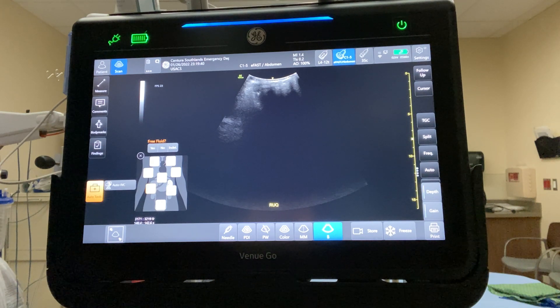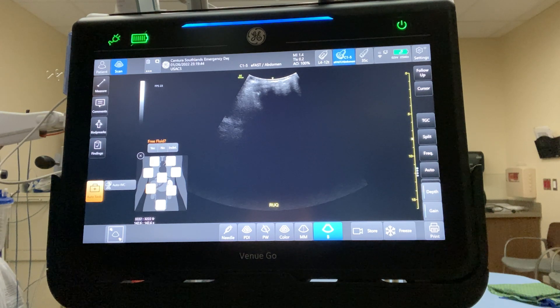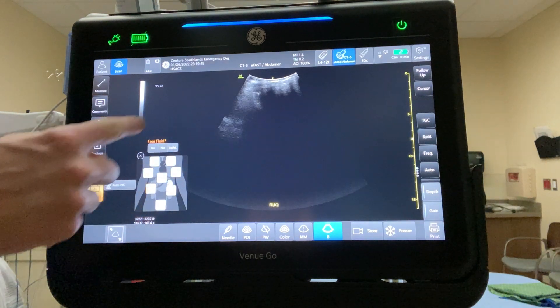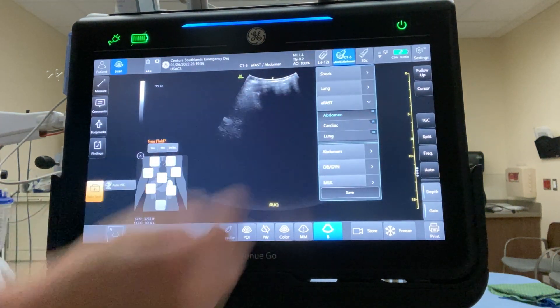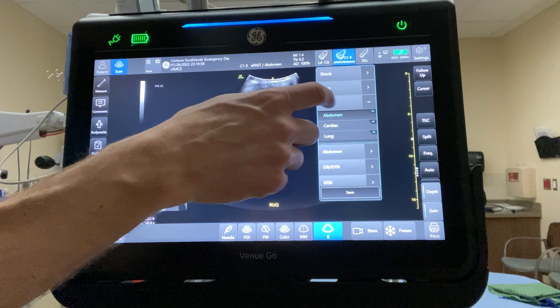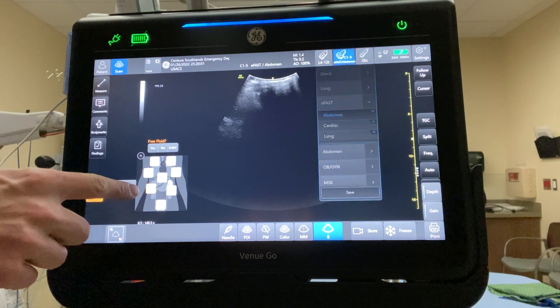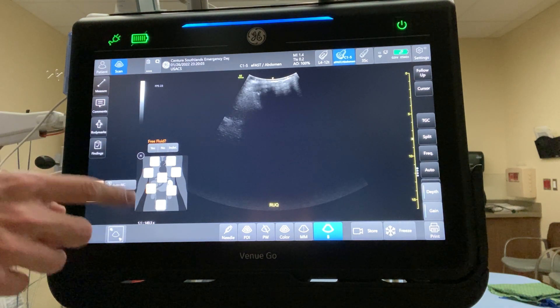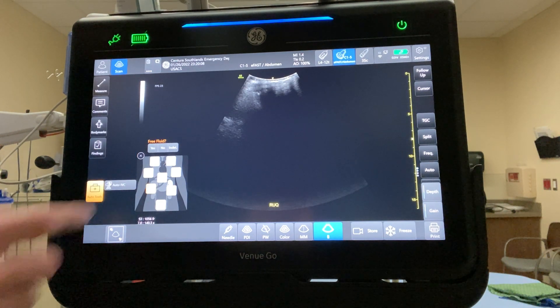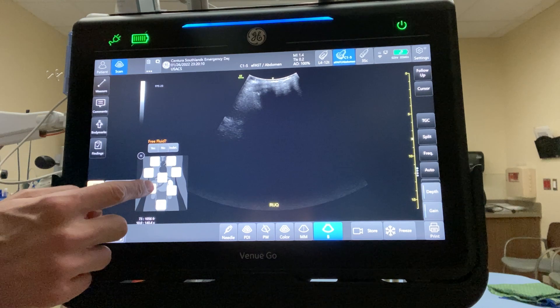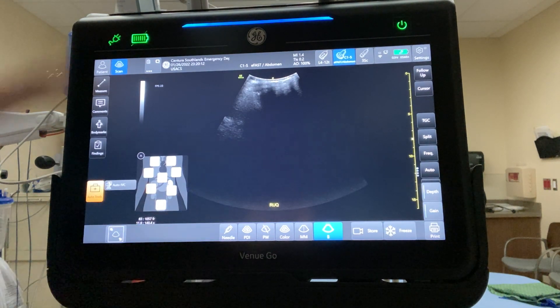In this video we're going to talk about saving your FAST exams. With the new FAST exam protocol, there's a little box on the left side of the screen that gives you a template on the body to click through. When you click on FAST exam in your abdominal probe setting and click on eFAST, it automatically loads the patient onto the abdominal probe. All you need to do is click the little box and it automatically gives you the right upper quadrant labeled.